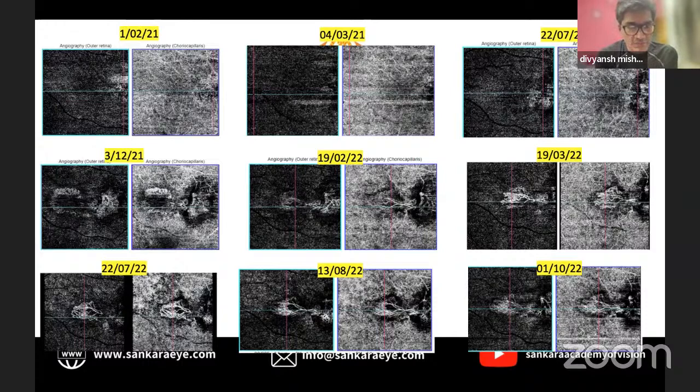The reason for planning TTT was that the lesion was a little larger. Focal laser, ideally, in such cases is not a good idea because the maximum spot size you can do is 500 microns, and the lesion, as we can see, is around 2.5 to 3 millimeters. So in a TTT, the advantage is, one, having a larger spot size. Second, the amount of energy which you are delivering is much lesser. And the adjacent damage, the expansion of the laser which is expected.